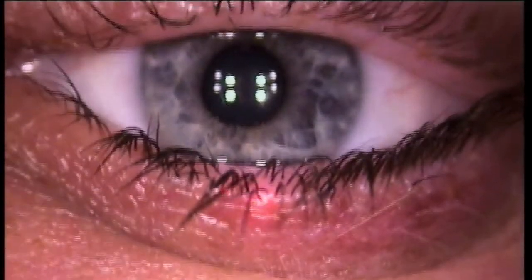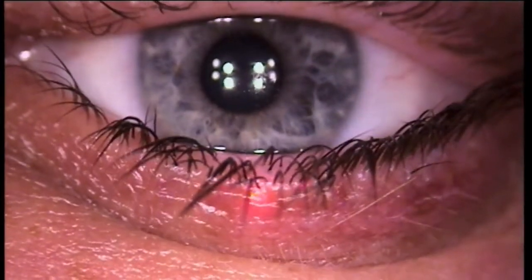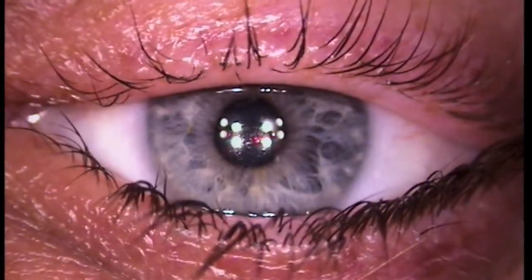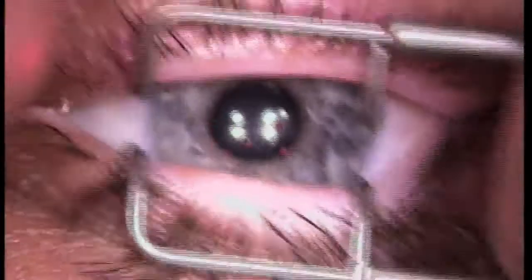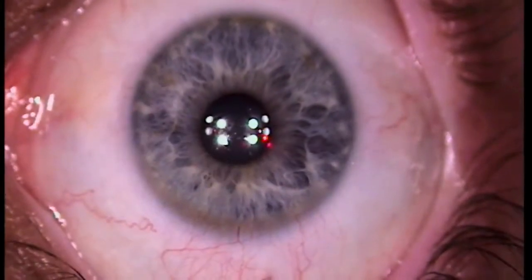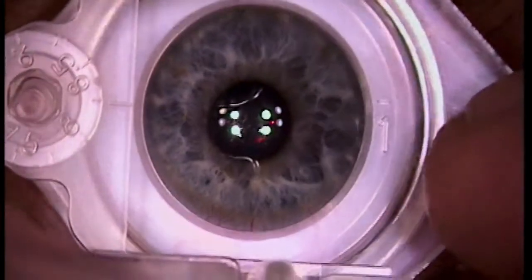No paint allowed though. Here's a little green light for you. Just going to tug a little bit on you just like that. And I'm going to test you — make sure the drops are working. I'm going to test you by pushing on you.